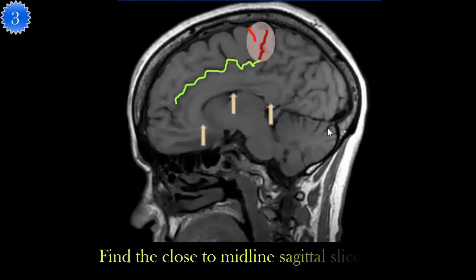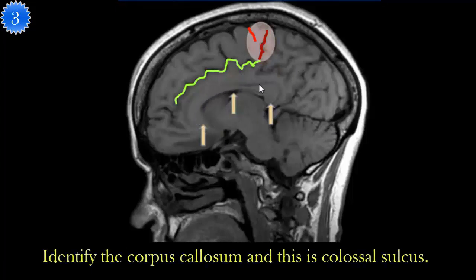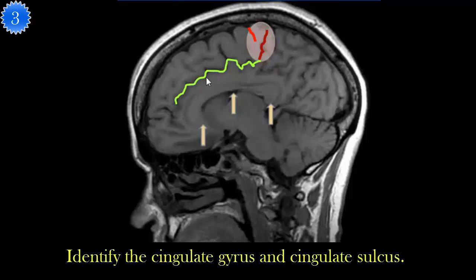Find the close to midline sagittal slice. Identify the corpus callosum. This is the corpus callosum and this is the callosal sulcus. Identify the cingulate gyrus. This is the cingulate gyrus and cingulate sulcus.